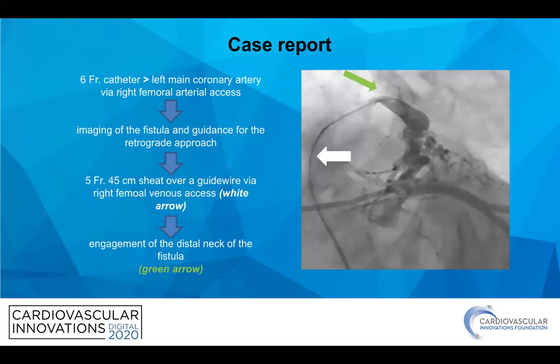We inserted a 6-French catheter into the left main coronary artery, which allowed us to image the fistula and also guide the retrograde approach. Via right femoral venous access, we inserted a 5-French 45-centimeter sheath over a guidewire. You can see this guidewire with the green arrow, and how we engaged it to the distal neck of the fistula.